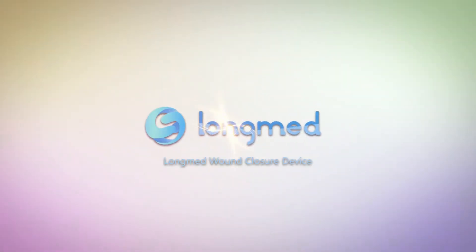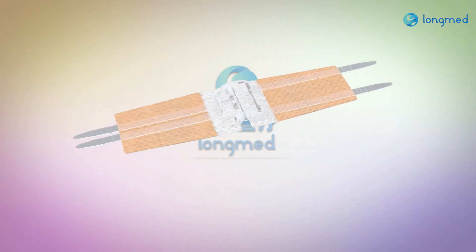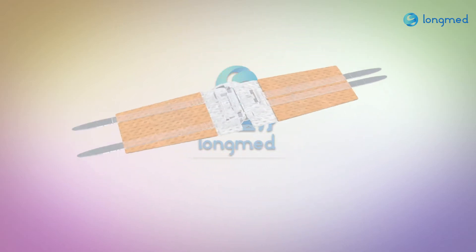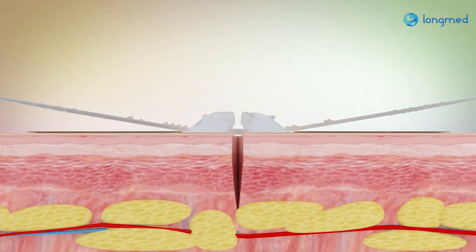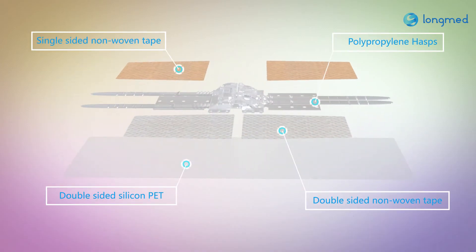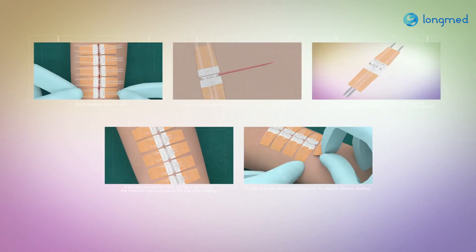Loan Med Medico Fuxa Macroport. The Loan Med wound closure device is an innovative product whose performance is far superior to similar products. Compared with other similar products, Loan Med has five advantages.